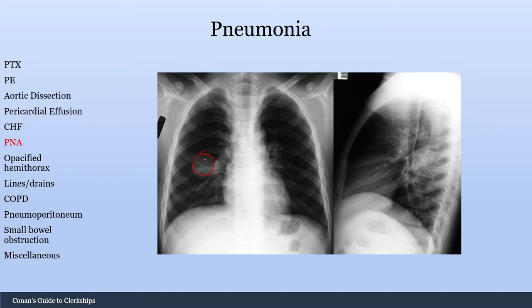This pneumonia here is pretty clear to see, but I'll illustrate a common misconception — this consolidation looks like it's in the middle of the lung, so you might call it a right middle lobe pneumonia. That's why you need the lateral X-ray. If you look at the lateral, it's actually a right lower lobe pneumonia — and I'll explain how that's the case.